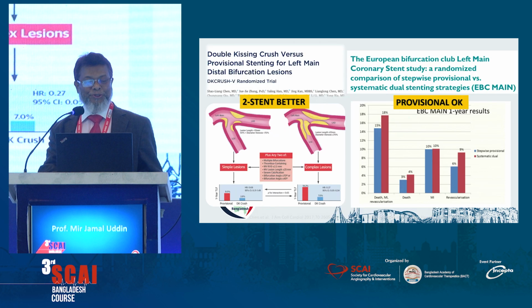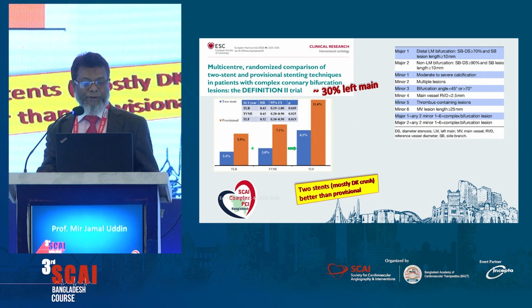And this slide is also shown, the two-stent strategy regarding the simple lesion and complex lesion. Here they have shown that in case of a complex lesion, you should do a complex intervention. In case of a simple lesion, you should do a simple intervention.